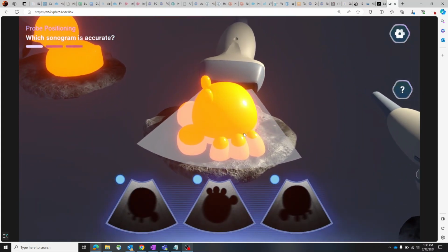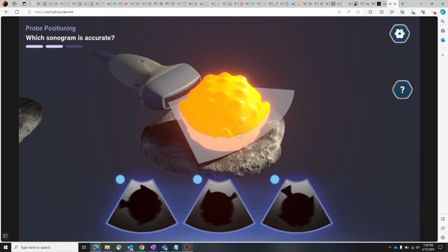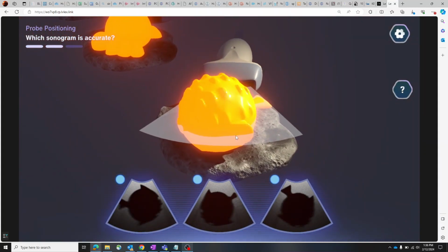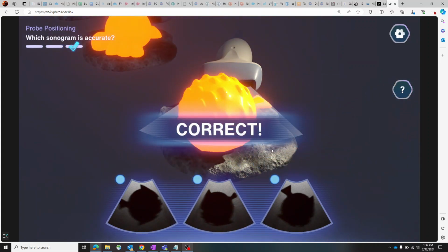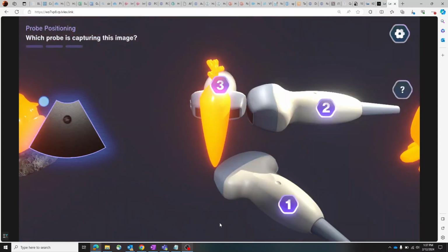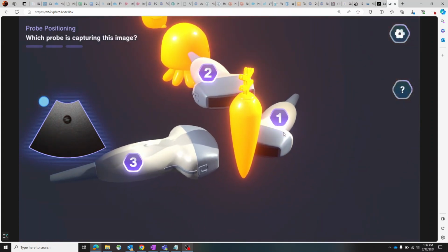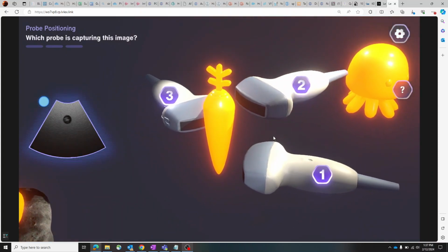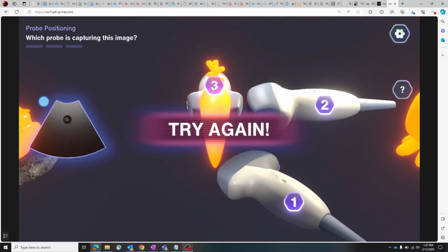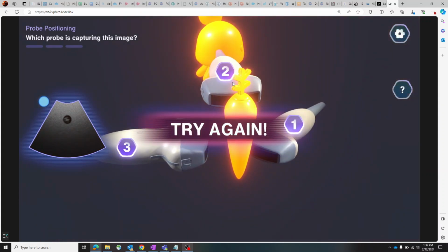What we found afterward is when people play in that scenario, we can create an example where there were like 5 or 6 patient monitoring systems, 5 or 6 different choices. You compound that and force them to make those decisions. We saw they kept coming back and playing, and we would score them, and then we would see how well they did the second time, and see improvement. So there are things that we can measure, and it's really a virtual sandbox. We can make anything that's desired, but we already have a lot of examples of people going back and playing more because of failure and not doing well. They want to go back, and it's that repeat play where we see a lot of results.